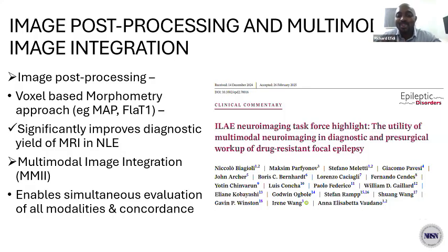And this is what the International League Against Epilepsy Neuroimaging Task Force has been able to demonstrate and encourage in the practice of epilepsy care, especially for tertiary centers that manage epilepsy. The use of multimodal image integration with image post-processing.